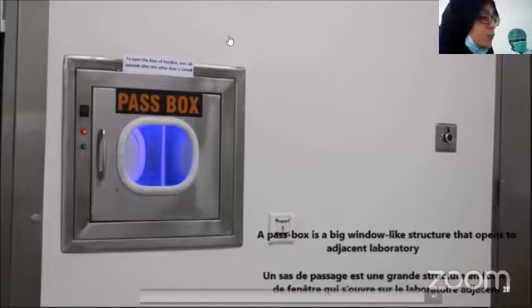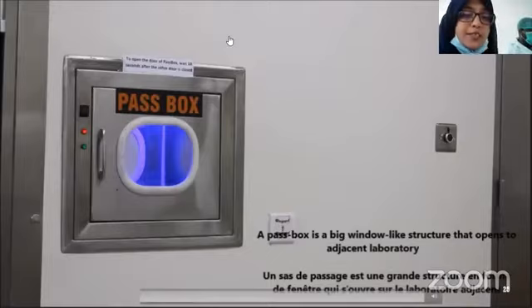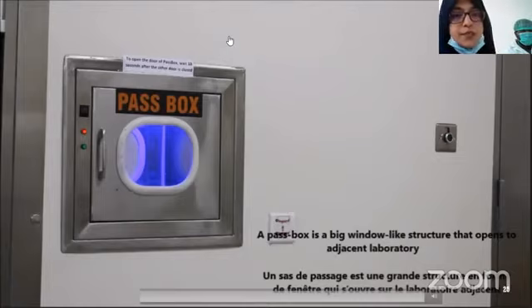And someone is asking about the numbering on the tubes. So it is the identification number of the patients, the particular patient identification number which we will use during the processing till the reporting process. So these are the two questions which I wanted to address before moving forward.